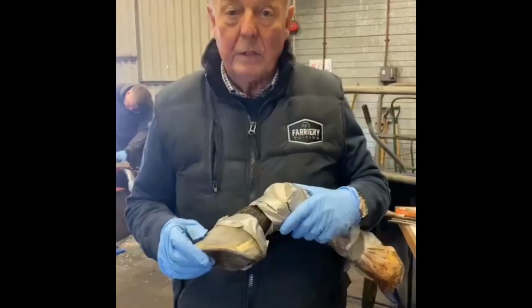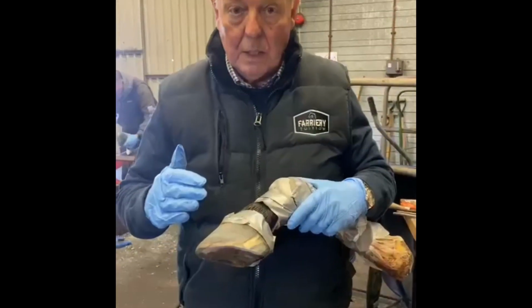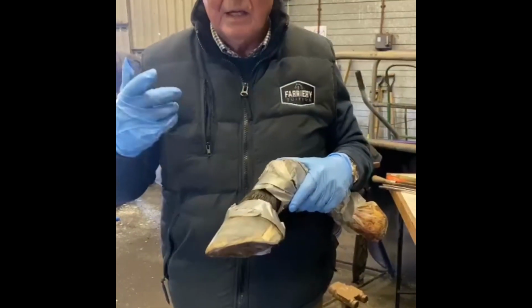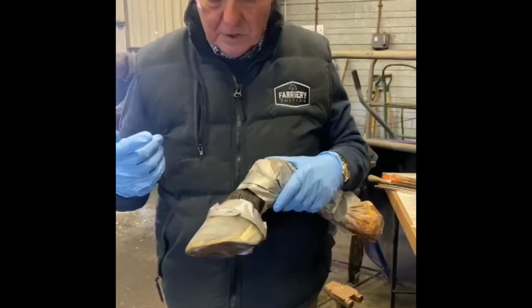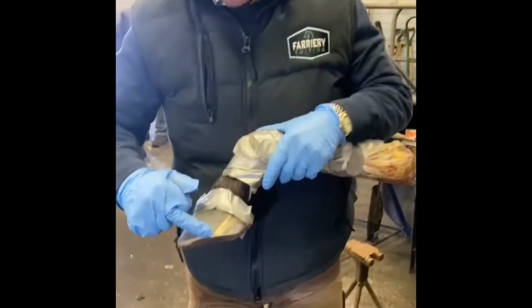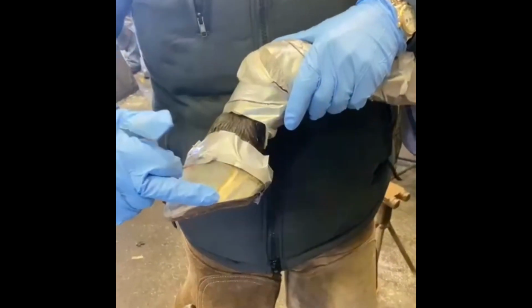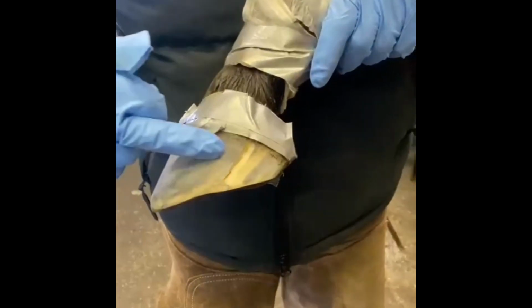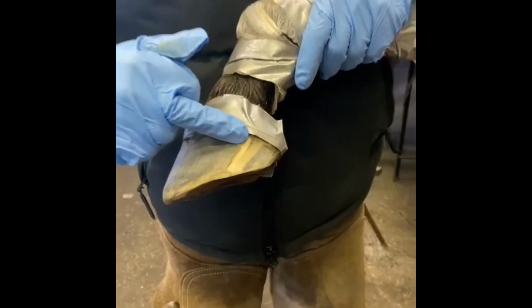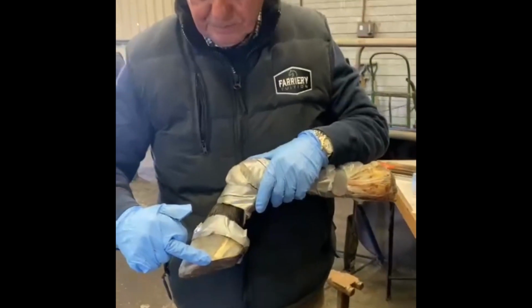Okay, so what we're going to do is a crack repair. I'm going to demonstrate a real simple crack repair of acrylic and fiberglass. We have a cadaver foot here, and we synthesised the crack at the quarter, a little bit further back from the quarter, very typical of coronary cracks that happen to athletic horses.